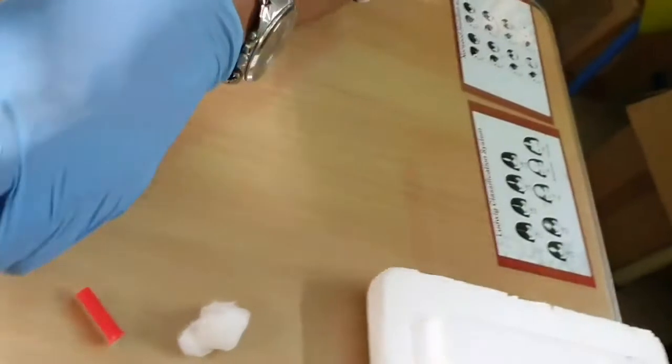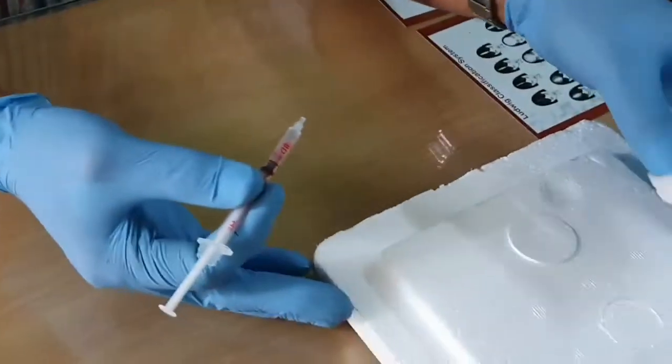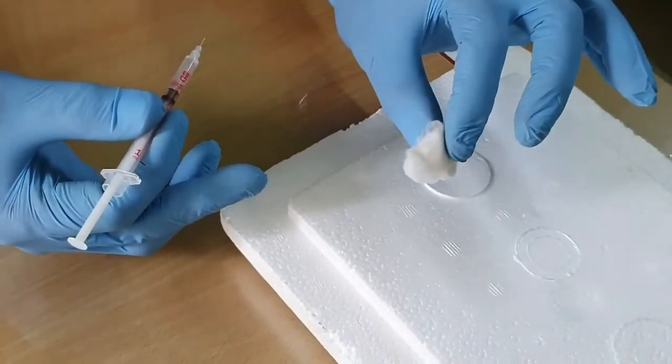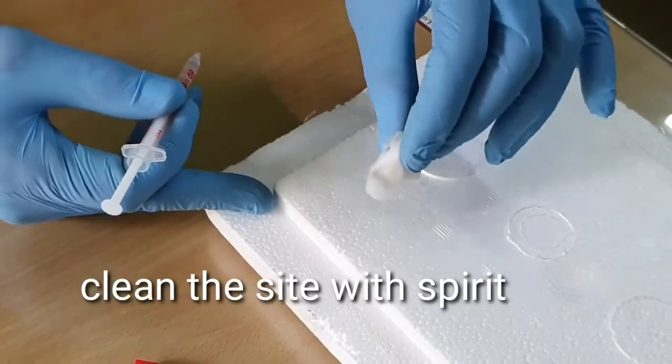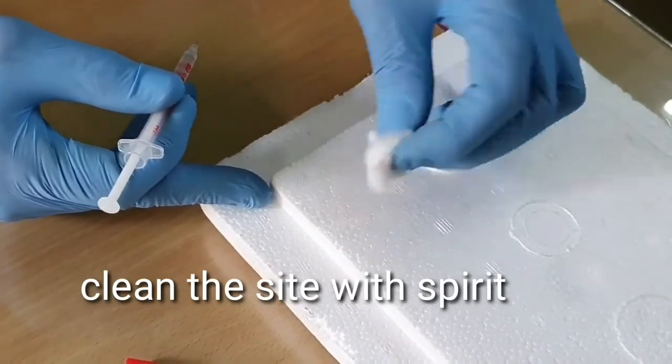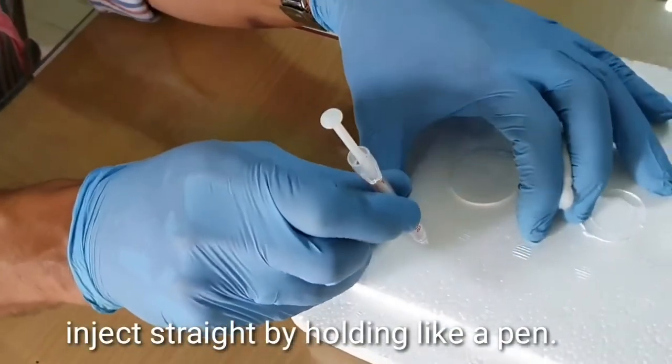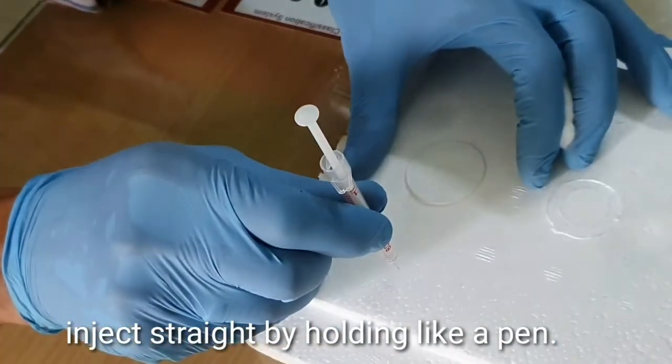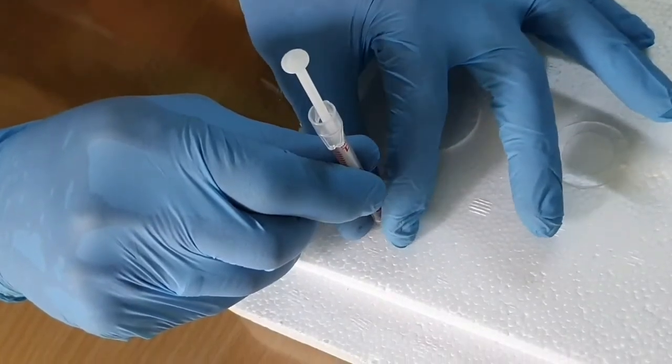Now again, hold it like a pen. I'm going to show it on a board instead of the body. You have to clean the site with spirit, and you hold the pen straight and inject. Now you stabilize the syringe with your left hand so that when you inject, the needle doesn't move.